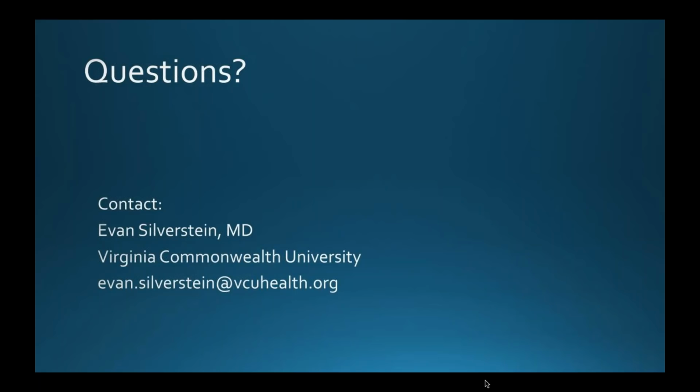That's a very good question and a difficult one to answer. As a pediatric ophthalmologist, I like to have children be screened, especially when they are less than 7, once a year, because like the United States Preventive Services Task Force says, you want to be able to identify and treat problems of low vision.